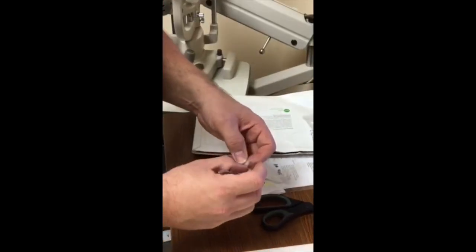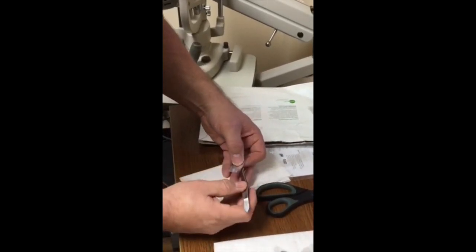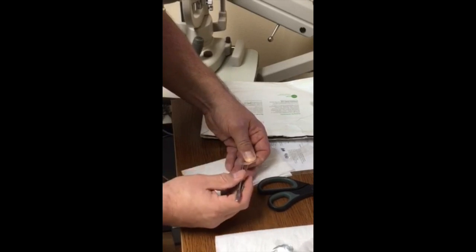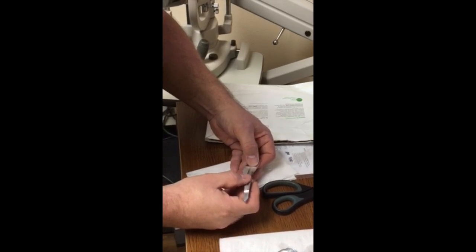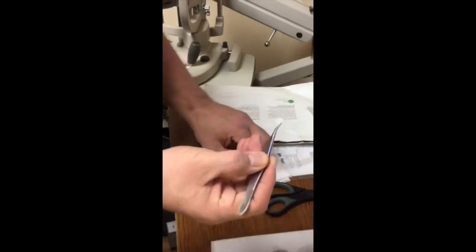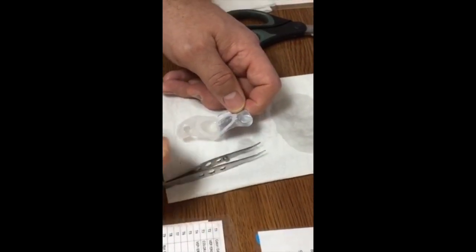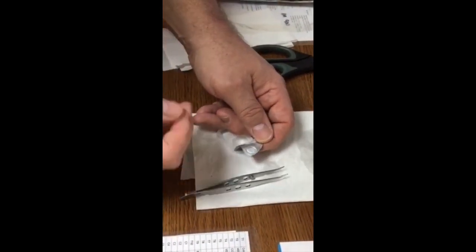Once we have it ready, be very careful — it will fly out and float around, which is a very expensive mistake. Now we remove it from the foil envelope, again being very careful. Once we have it, it's ready to go, and I will just place it into the bandage contact lens. I put it on the spot that's going to be inferior on the patient's eye, and now we're prepared to place the bandage contact lens with the amniotic membrane in the patient's eye.